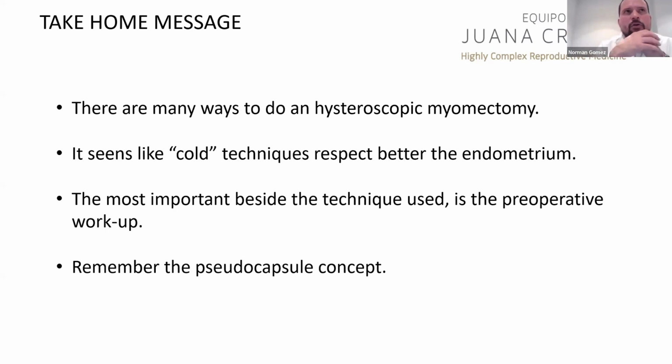There are no papers or publications saying that the cold techniques have better reproductive outcomes today. We don't have evidence about that, but there is evidence that the use of energy inside the uterine cavity creates more adhesions inside the uterine cavity. This is one fact, so we need to take it into account.